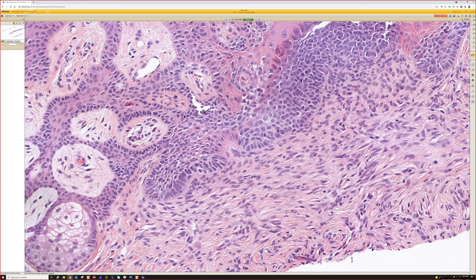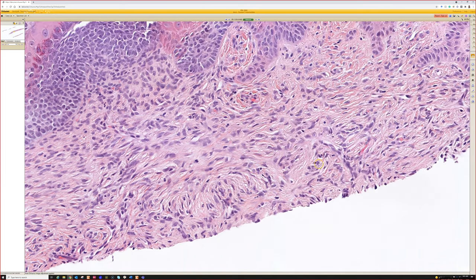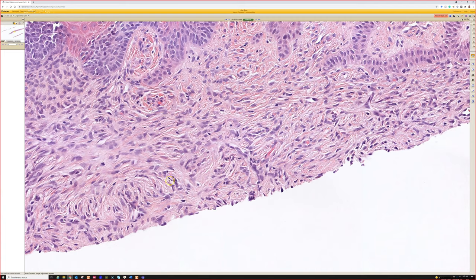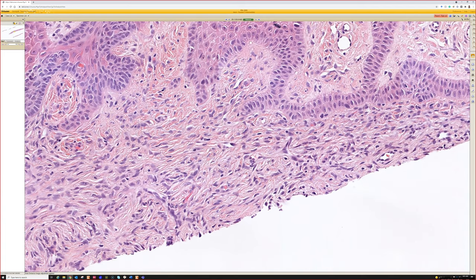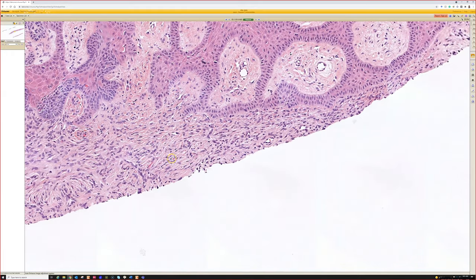Also, the presence of all these spindle cells in the dermis swirling around and wrapping around little tiny bits of collagen is characteristic of dermatofibroma.